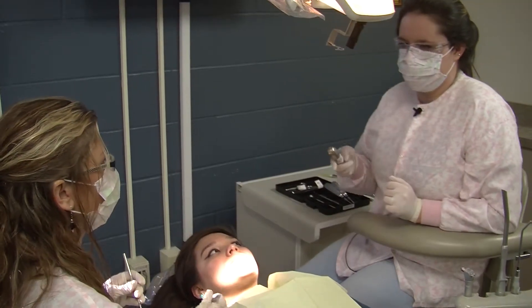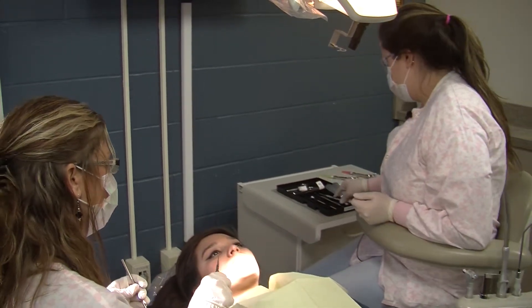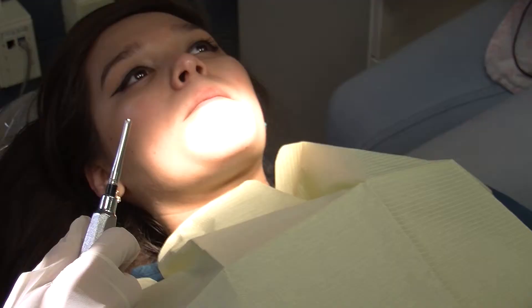Then we're going to grab the elevators — small to large. The small breaks off a little bit, medium some more, and then large a whole lot. After that we're going to use the forceps to extract the tooth.